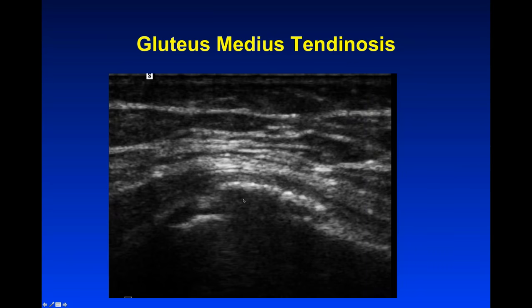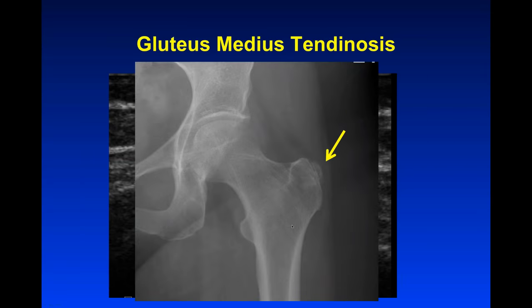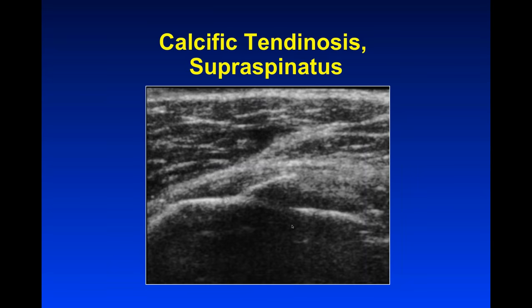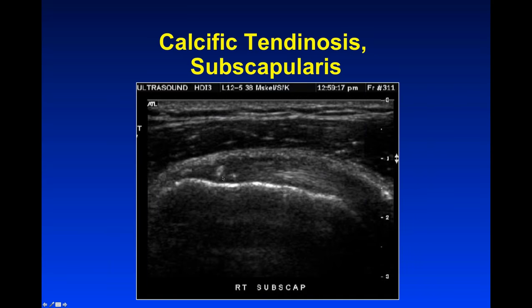Calcifications within a tendon look like calcifications elsewhere in the body — very bright — and depending on how hard they are, they may or may not shadow the beam. This is the gluteus medius tendon of the lateral thigh, with a very bright shadowing structure superficially, confirmed by the plain film showing a calcification sitting within the tendon on top of the bone. Here's also a calcification within the rotator cuff, echogenic with posterior acoustic shadowing. Sometimes echogenic areas are too small or too soft to create a shadow, so you just see bright foci with no shadowing — beware that calcifications don't always shadow.